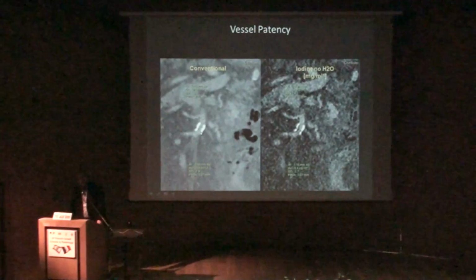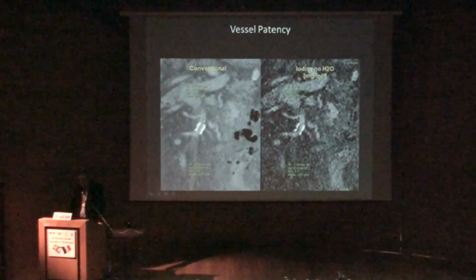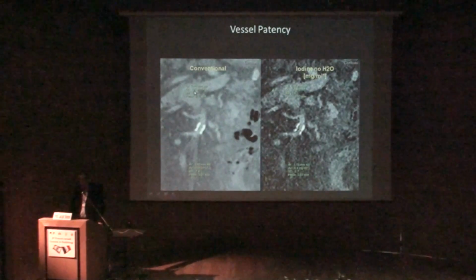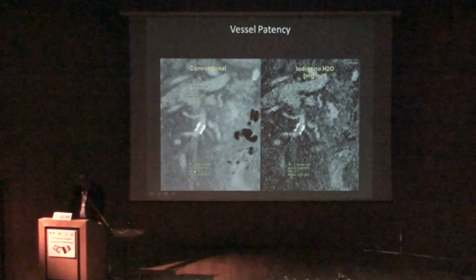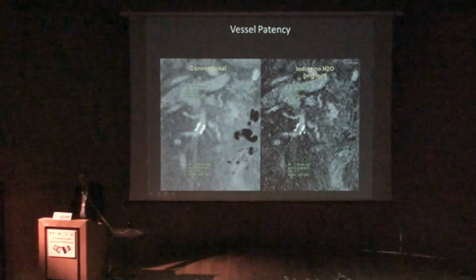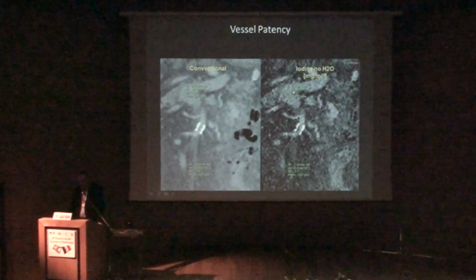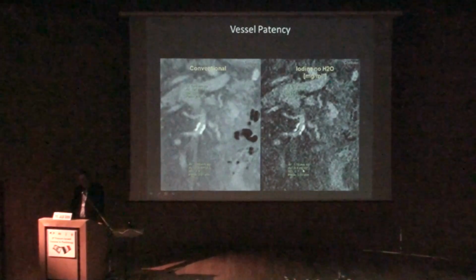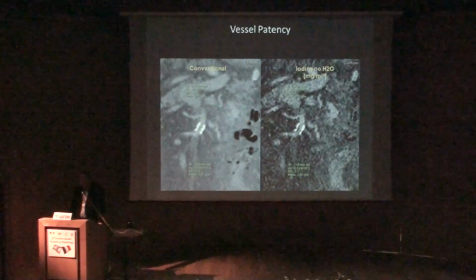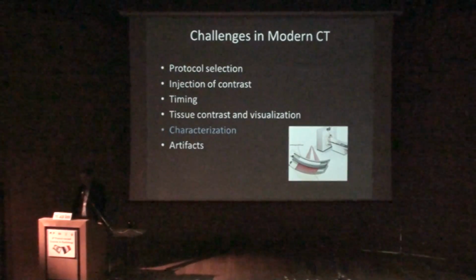We all hear about beam hardening, so let's look at what beam hardening is. This is the SMA before the stent, and the average density is 197. It goes up to 250. That's not real, it's beam hardening. The HU value is higher. If we look at the iodine in milligrams, this is 9.2 milligrams, and this is 9.4 milligrams per ml, and the numbers match. So we are much more precise in quantification of iodine within those vessels by using dual energy.